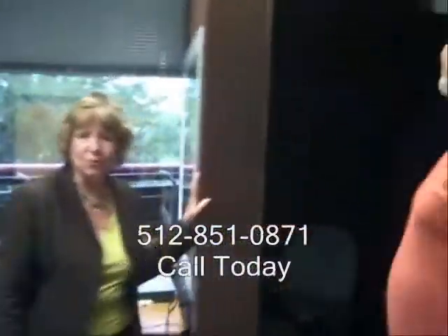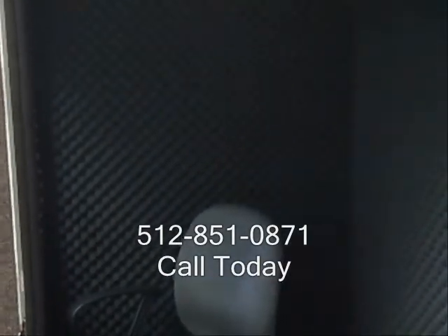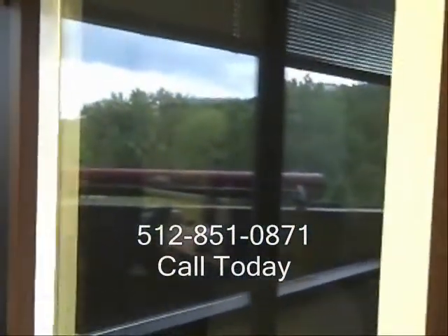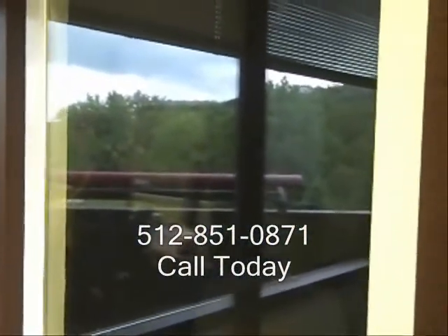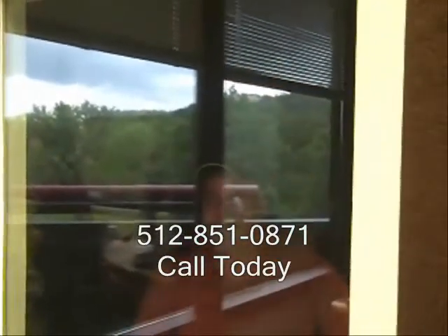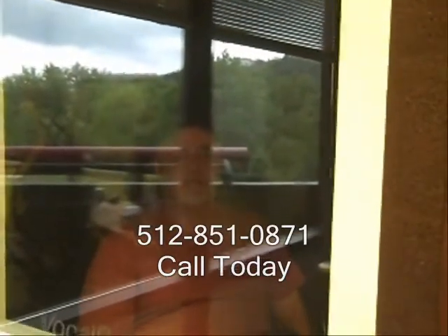This is a vocal booth, and this is one of the better hearing testing booths that I could find. It has a nice interior treatment, but more importantly, it has this big window so that when people come in here, they don't feel like they're closed in. I can remember having somebody come in Dallas one time and crying because they did not want to go into the booth. And I just don't want to have that happen to anybody.